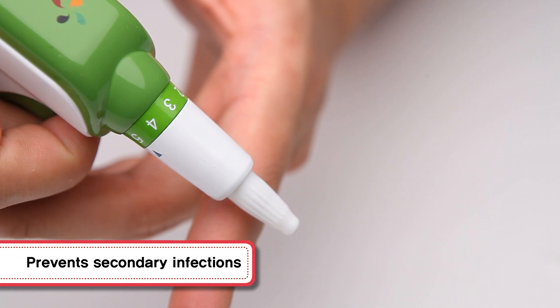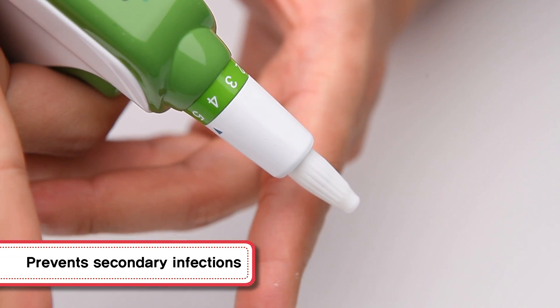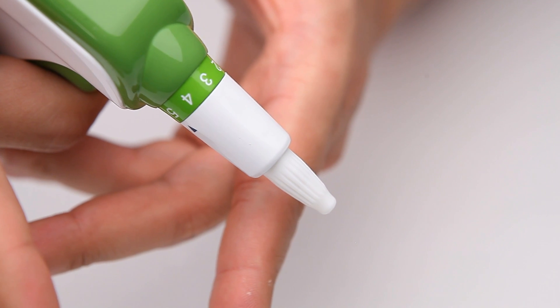By designing the protective cap to be discarded after use, it prevents any secondary infections from bloodstains.